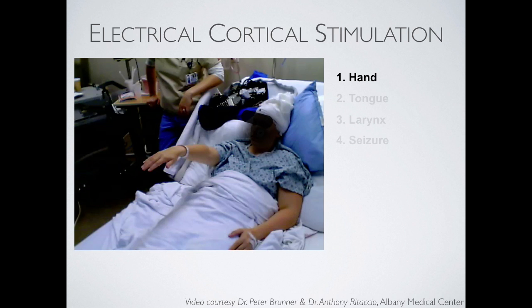It's what we call a lesional approach, which means the idea is for the epileptologist to work with the patient to generate a series of behaviors and then try to essentially interrupt those behaviors with electrical stimulation. And the idea is very simple. If I zap this part of your brain when you're doing it and you can't do it anymore, then that part of your brain must be necessary, not just sufficient, but necessary for that function. So that would be an area you would want to tell the surgeon to stay away from.